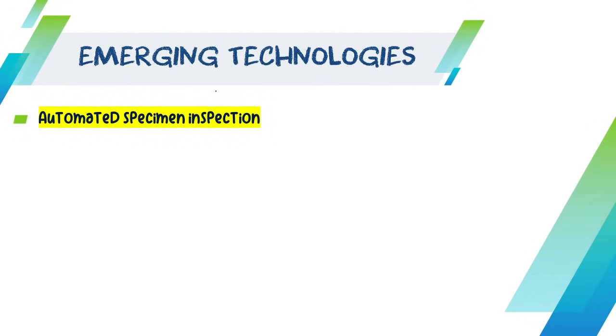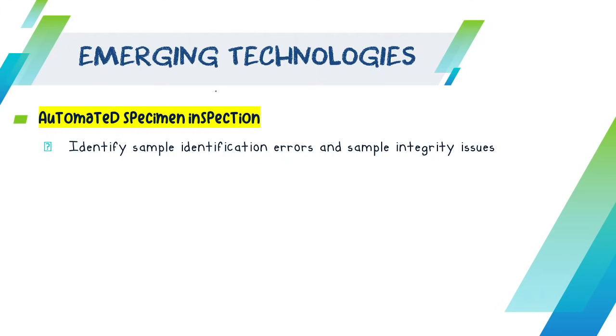So other emerging technologies as of the moment, one is your automated specimen inspection. Actually, while I was reading the definition of this, I guess this is found in your Henry's, medyo na-amaze ko. And when I tried to search for videos about this one, daghan na po jud og mga machines na naaiing ani na klase of automation, your automated specimen inspection. So what is this all about?